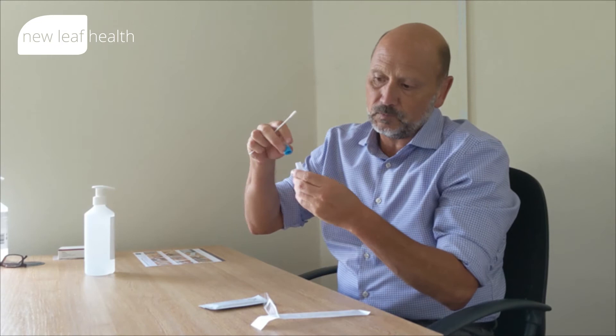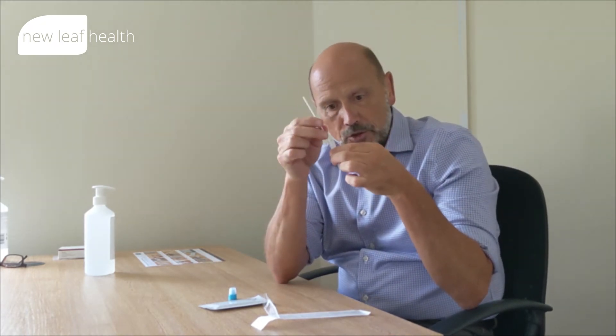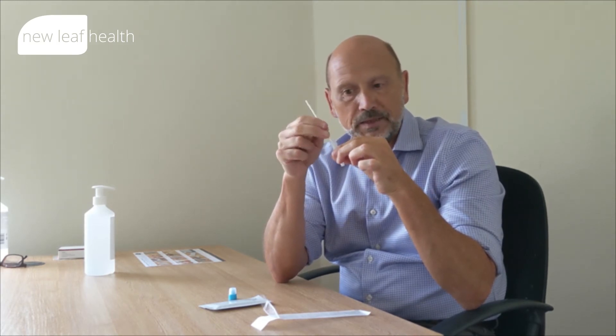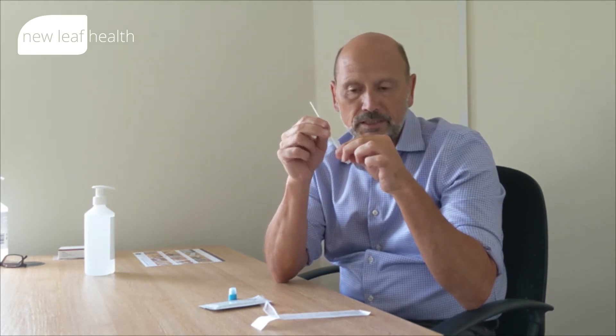So I've got my specimen. Open up the buffer extraction tube, pop the swab in, and just spend 20 to 30 seconds mixing that swab — just tapping it around the sides, then squeezing, then tapping around the sides again. Keep the swab in the solution, mixing it around. 20 to 30 seconds — don't speed this process up — and then you will have a good sample to put onto the testing cassette.